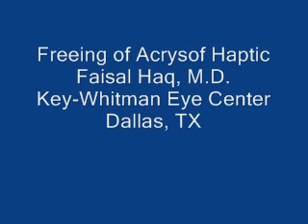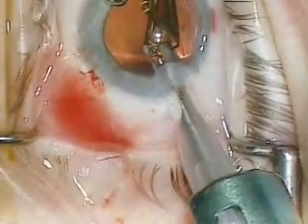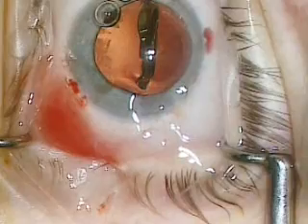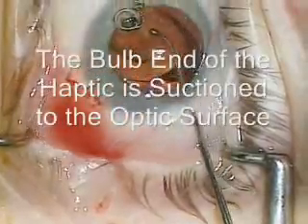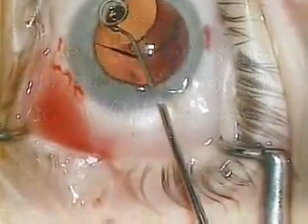This video describes a case of the Acrysof Haptic being stuck or suctioned down to the optic of the lens. Although this is a relatively uncommon occurrence, this video demonstrates a very easy way to free up the bulb end of the haptic.